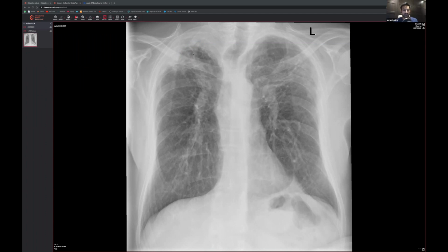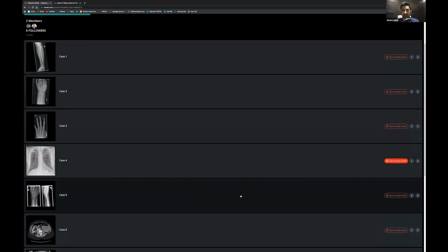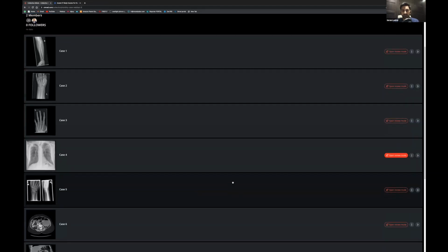scarring or fibrosis. So, this is not an acute study, but probably something that you don't want to ignore, especially if someone comes in with shortness of breath. And sometimes this is the first time they've turned up, and now they're going to have to go to the respiratory team, be put on medications, and look into the clinical history as to why they've ended up in this particular situation.